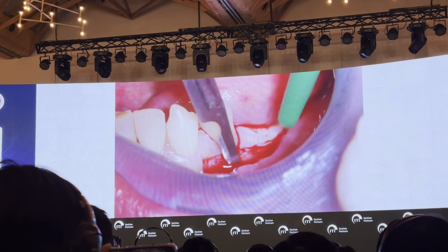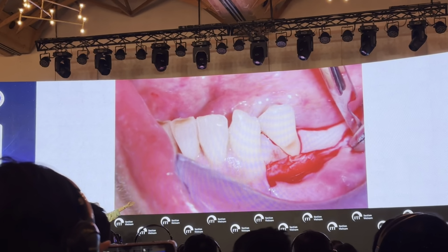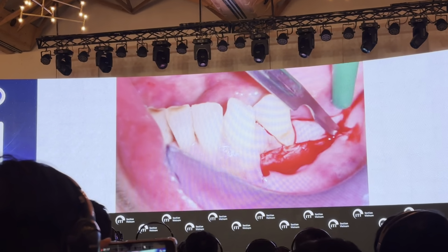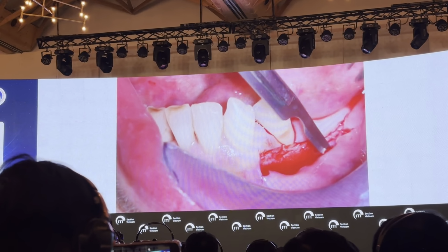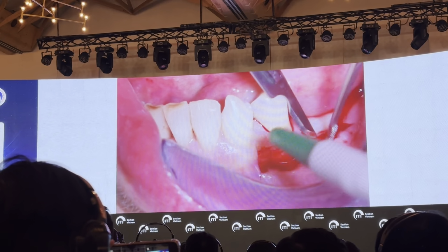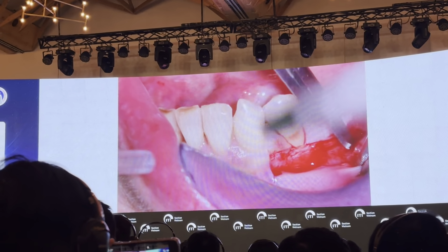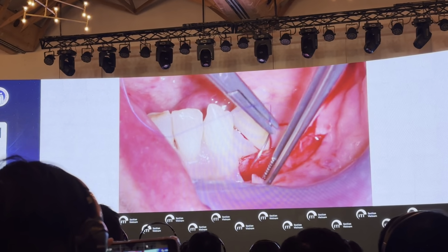the occlusal keratinized tissue, while in the buccal aspect, I'm raising the flap, deep split thickness, to create an area of periosteum free from muscles, being careful of the position of the mental nerve in this area.